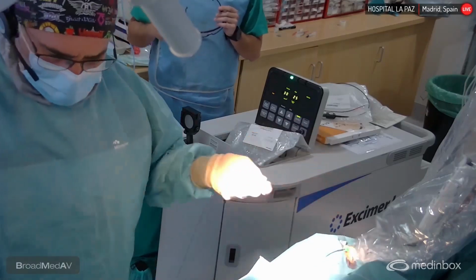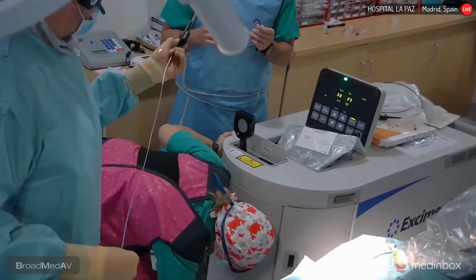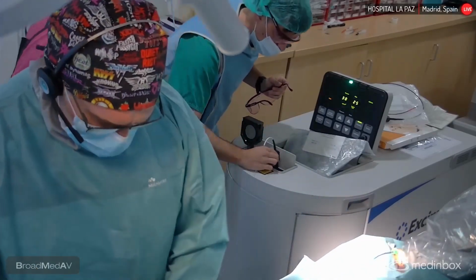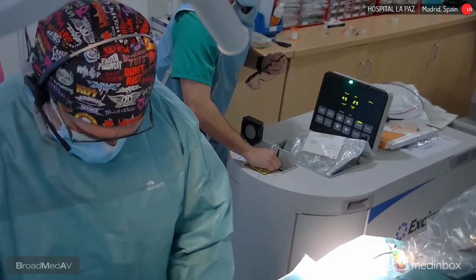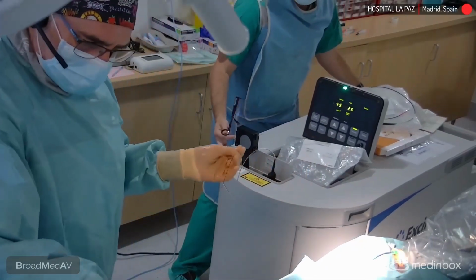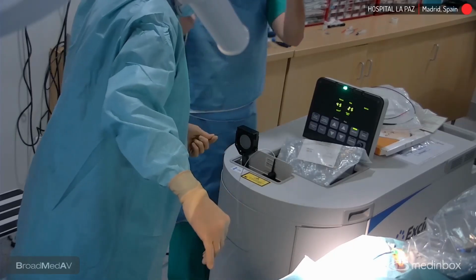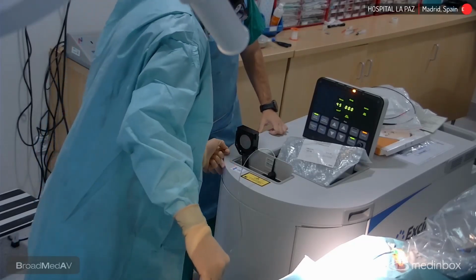Esta parte para Dani. Y aquí cogemos con el mosquito lo que te decía antes, ¿vale? Espera, vamos a hacerlo al revés. Vamos a darle primero esta parte a él. Sujétame, por favor. This is for you, Dani. Sujétame esto por este lado y esto para que no se nos caiga. So there is one sterile segment of the laser wire, and there is another sterile segment. A ver si puedes con las otras. Cuando me digas.